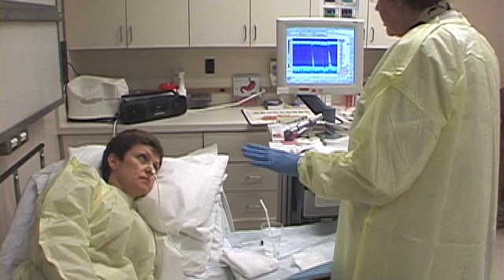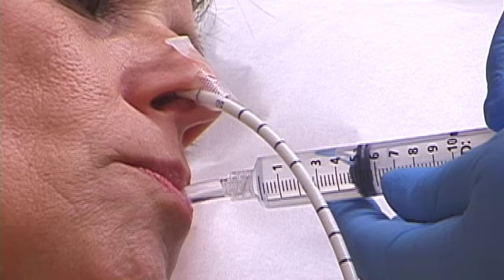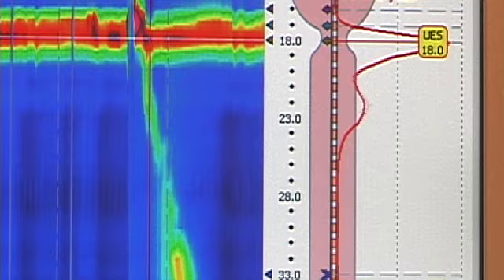The patient is asked to lay down on their side, breathe normally and remain still without swallowing, as a baseline reading is taken. The process continues with the patient given five cc's of water, and the path of the liquid is tracked as it makes its way down the esophagus to the stomach.